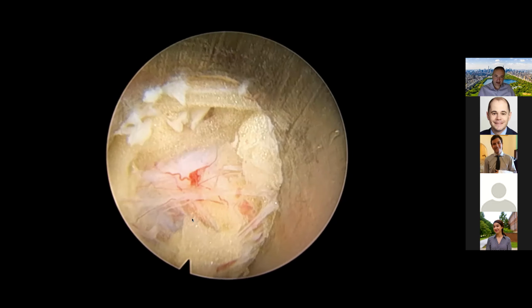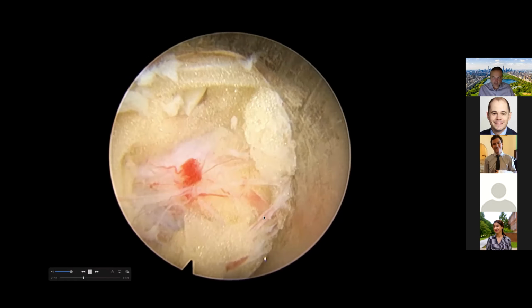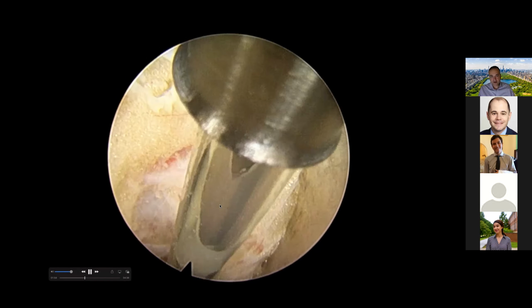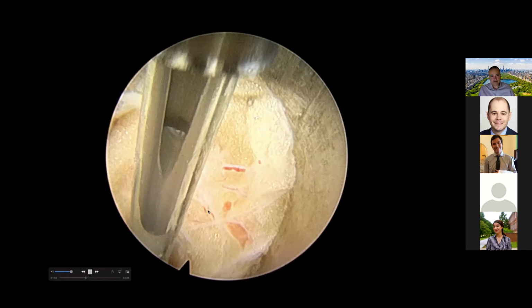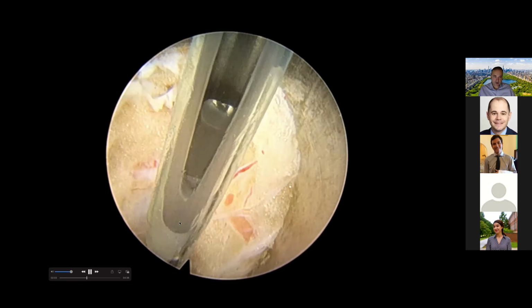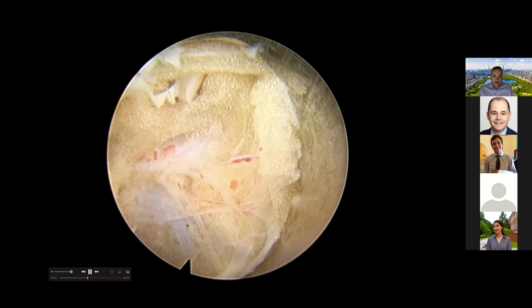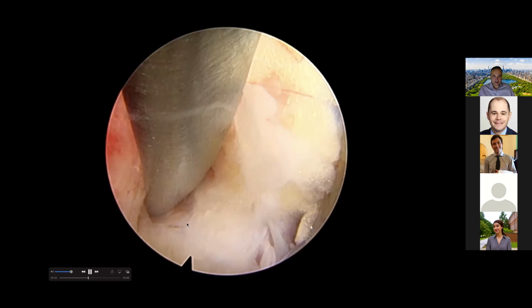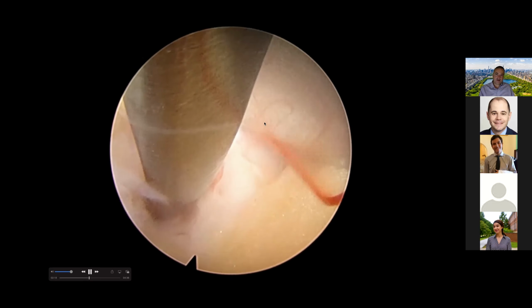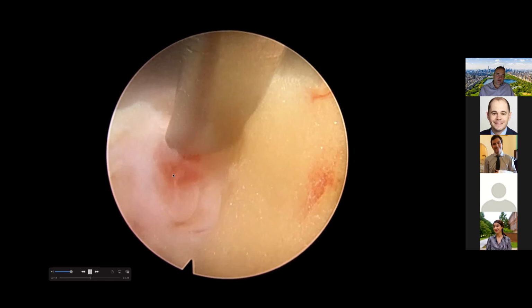You see these tiny epidural veins. When we're doing an open approach, we don't really see them that well, even under the microscope. You don't get that magnified view as you can get with the endoscope. And here we're using the cautery to just dissect around to recognize the pathology. And here's the rotational maneuver that we're doing. And now the pathology is right in front of us.